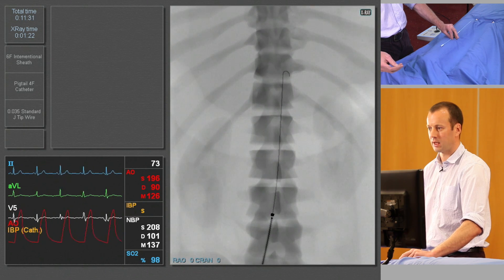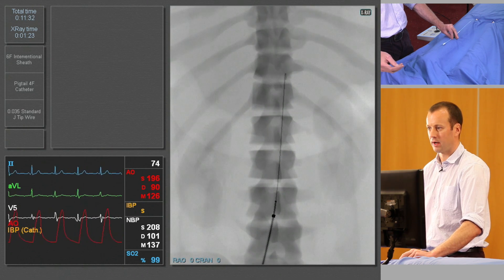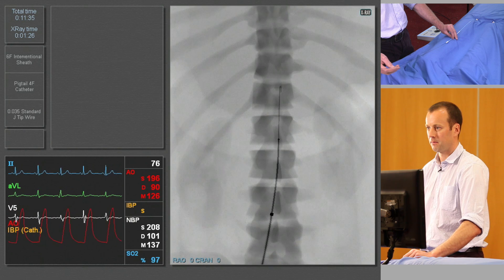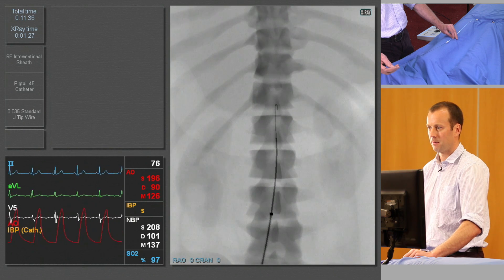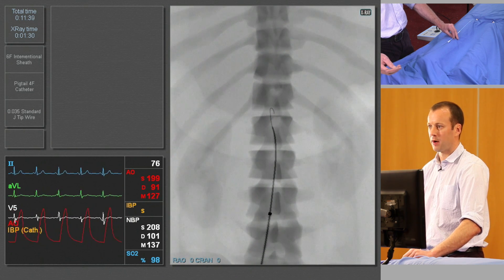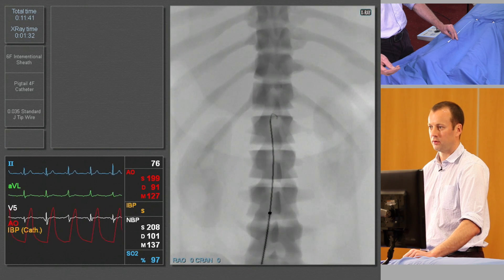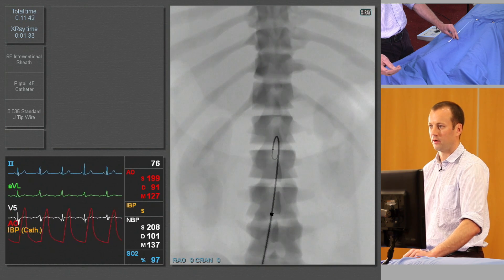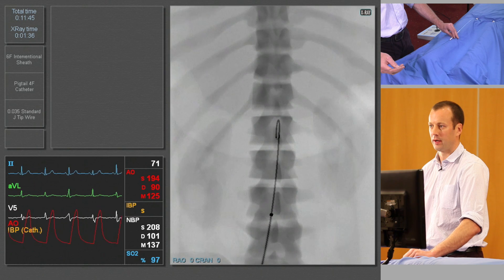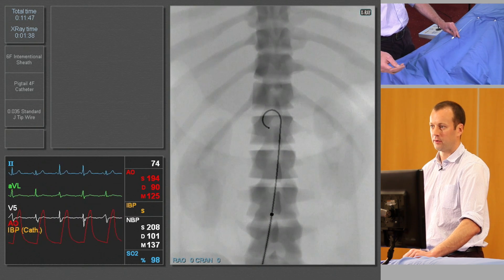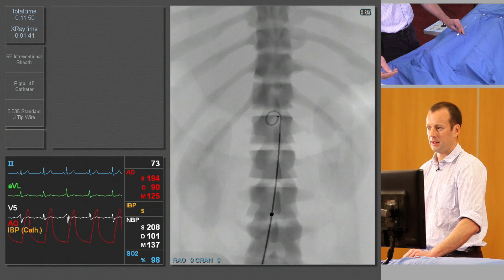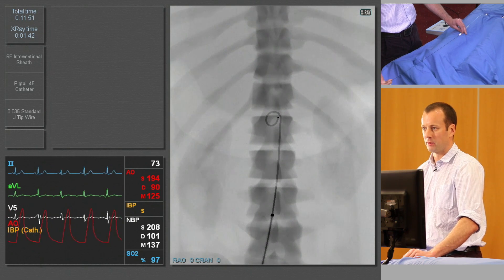As always, the aim is to keep the tip of the guide wire in the same place. Advance the pigtail catheter past the level of the renal arteries, which you'll know is generally speaking at the junction between the L1 and L2 vertebrae. And then we remove the guide wire.